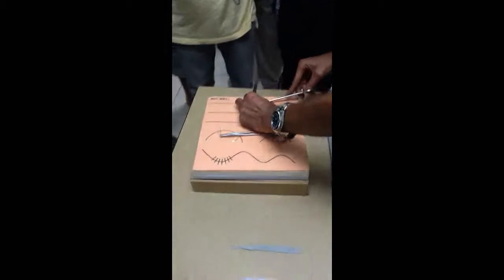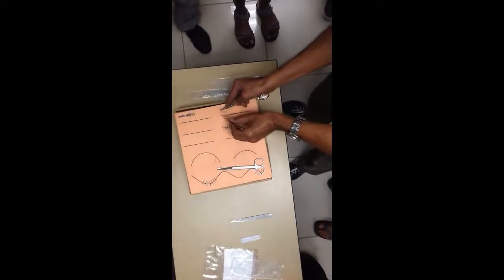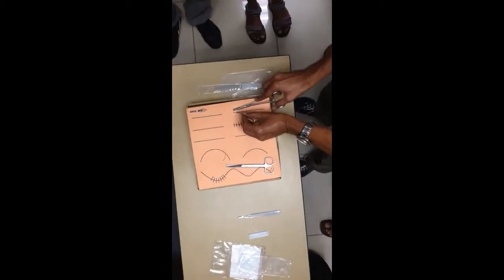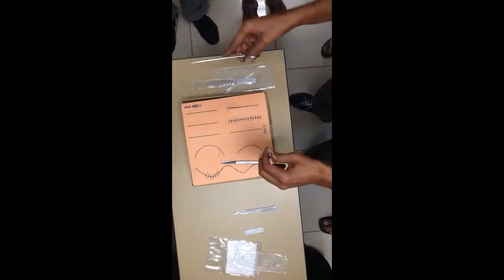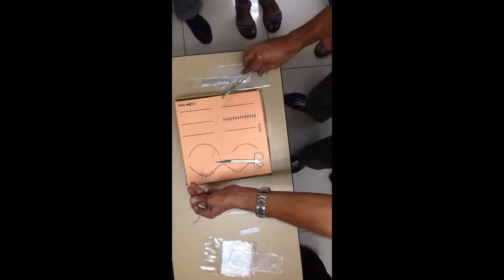Linea alba is a tough, fibrous layer in the midline where all the fibers mesh together. So let's assume that this is the linea alba. Before we start, let me remove all these knots here. The first step is to take a full-thickness bite as usual, then a full-thickness bite on the other side without taking the needle out. Push it, grab hold of this end, and pull it out. Always remember, there's always an assistant on the other side assisting you. Take double throws and put the first knot.